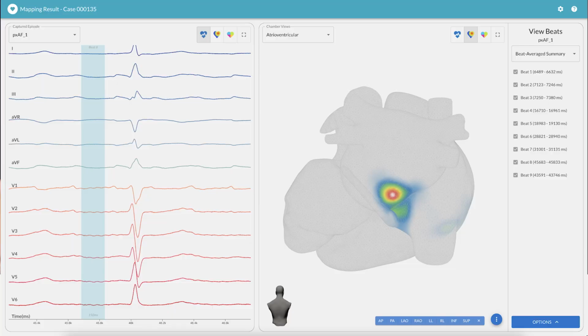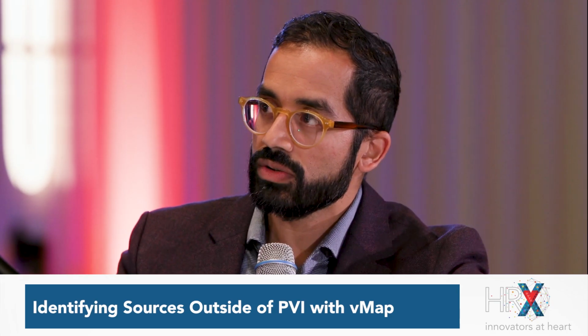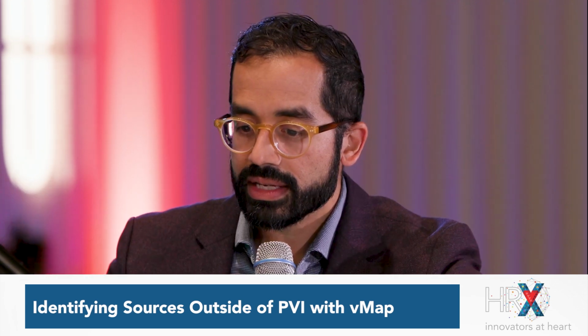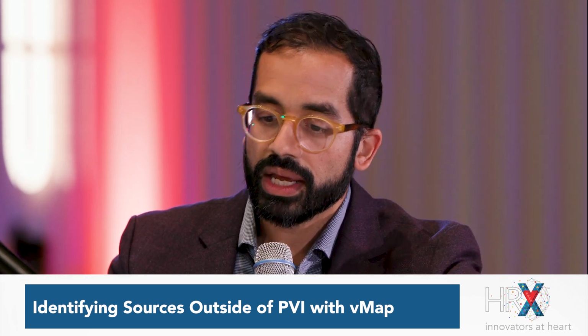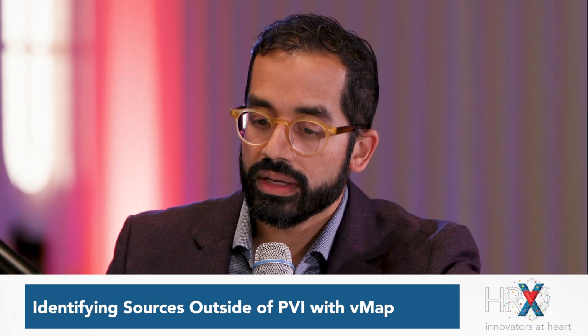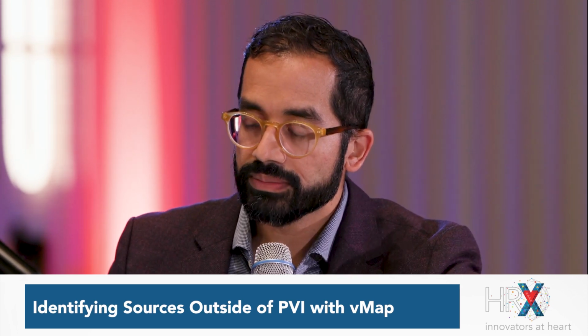The way Vektor works essentially is using previously simulated ECGs and previously described models of scar and conduction velocities in both the atrium and ventricles. It will recognize a patient's ECG and try to forward derive where an ectopic focus may be.